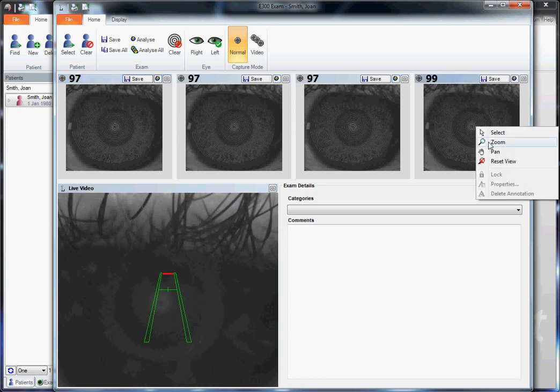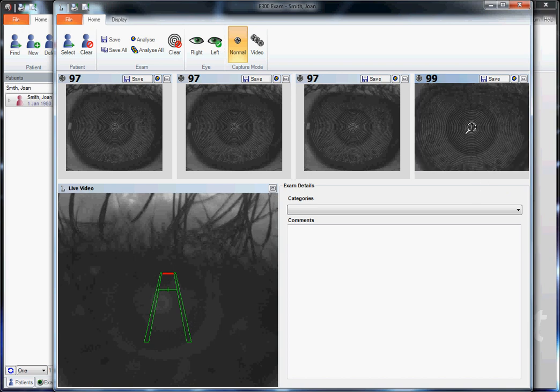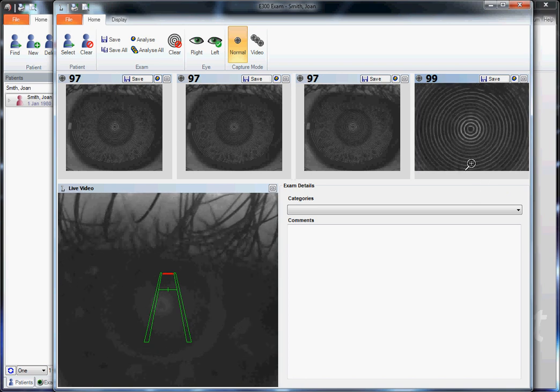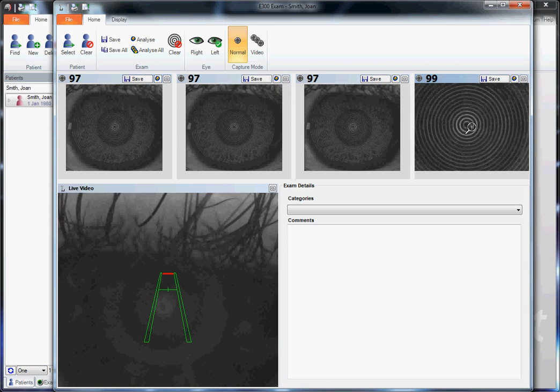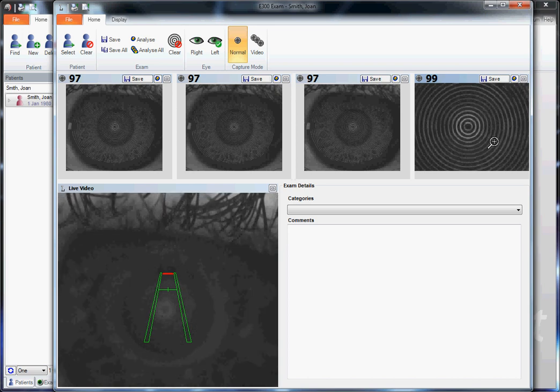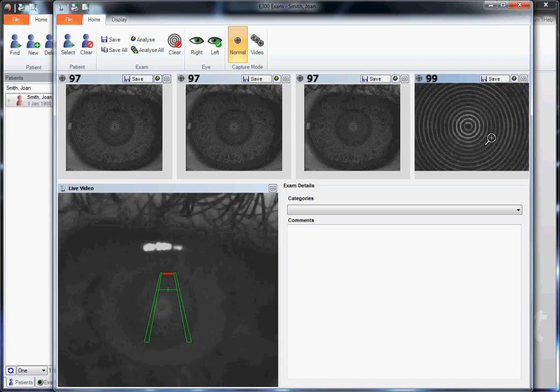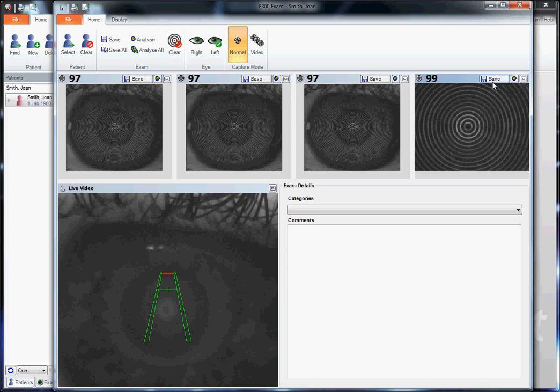Let's right click, select zoom, and zoom in on these central rings to determine if they appear parallel and even to each other. These rings are looking very good, so we'll click save.